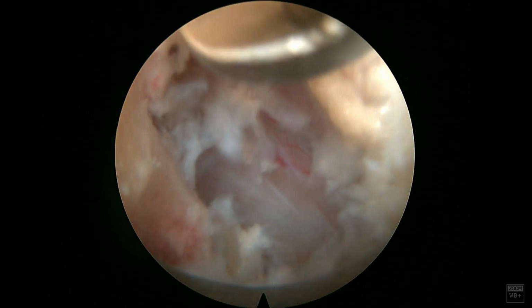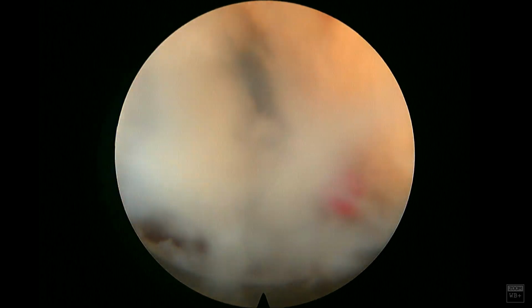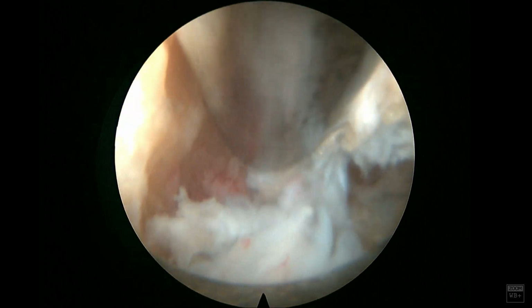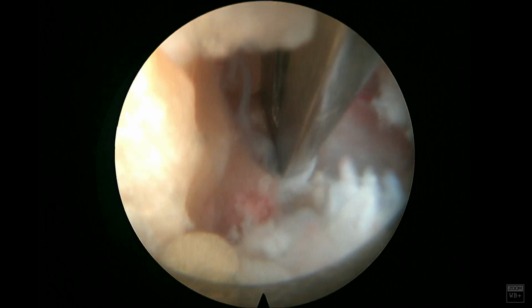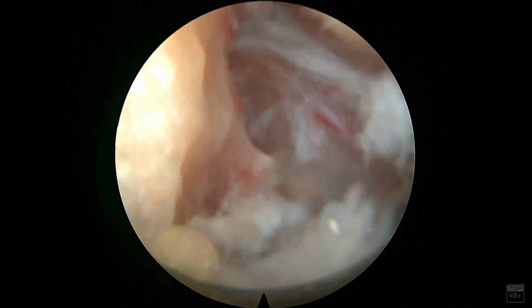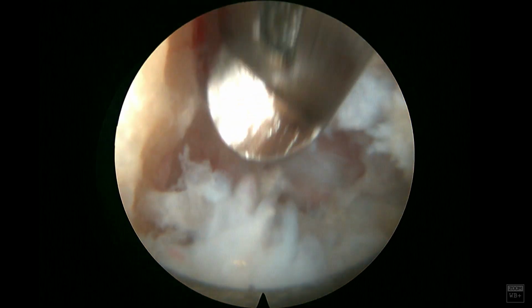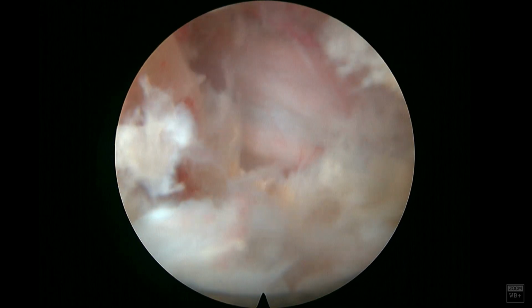So again, these Kerrisons are well made, but since they're endoscopic, they're not very strong. You can see that the superior lateral aspect of the lamina is still a little bit thick. I really try not to waste too much time using the Kerrisons to get this bone, because it's not going to be fruitful. So I'll get the small shell, but then I'll use either a side cutting burr or a diamond burr to really thin out the bone before I start using the Kerrison. In my mind, the Kerrison is usually used for small bony work or any tedious work I want to decompress, rather than using it for the bulk of my decompression.